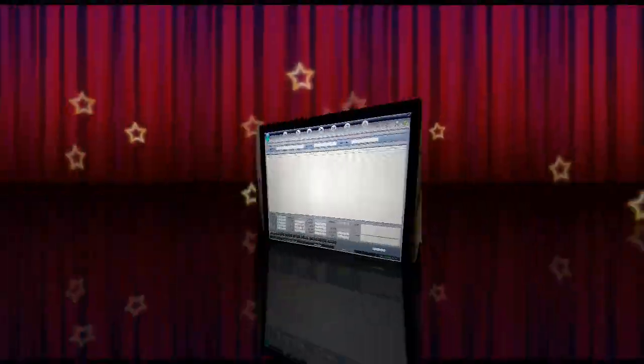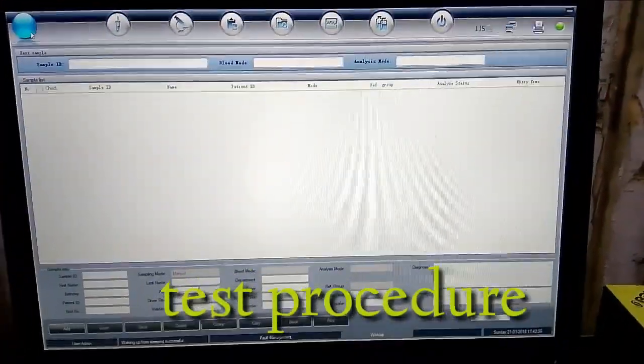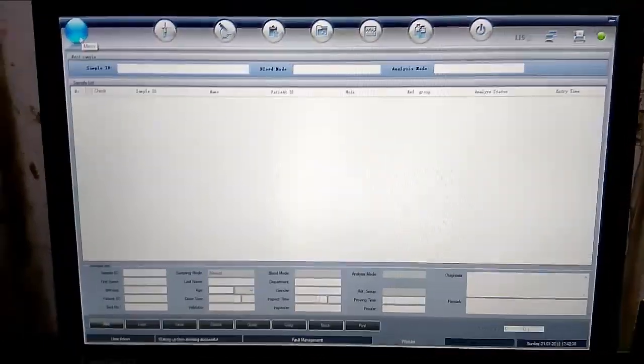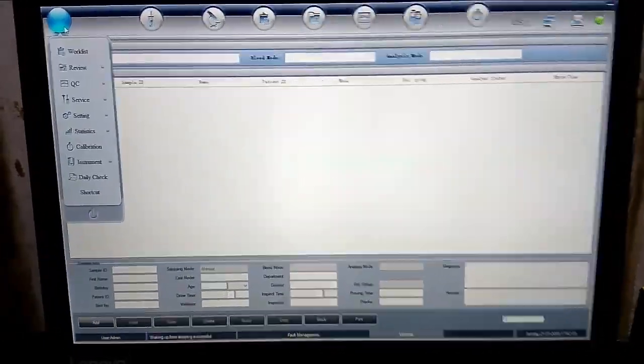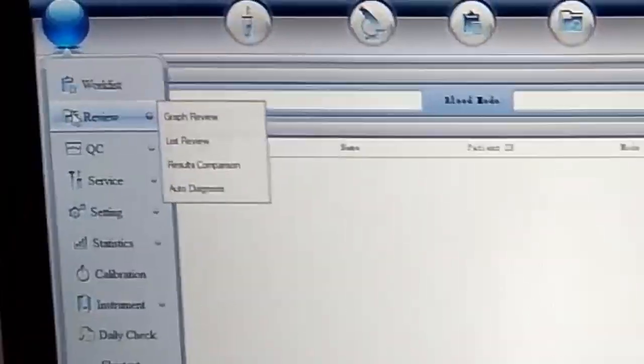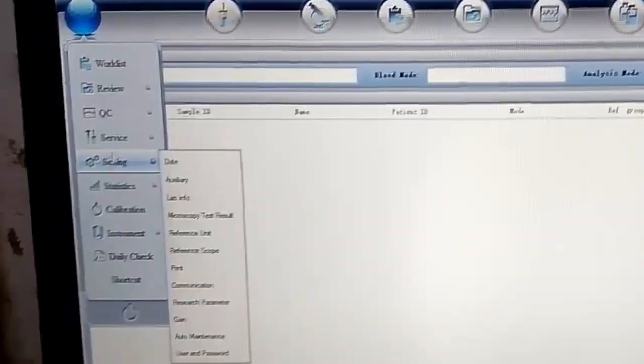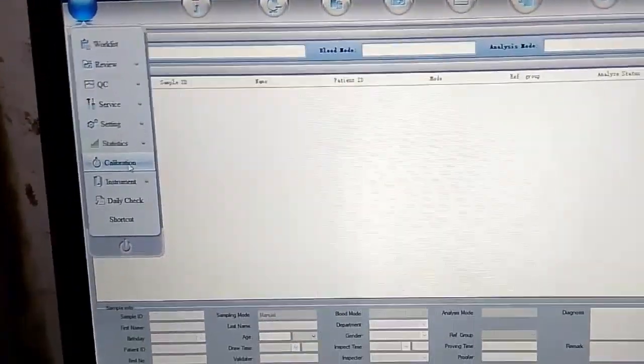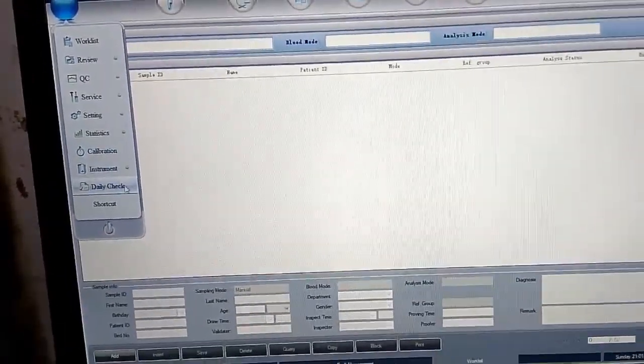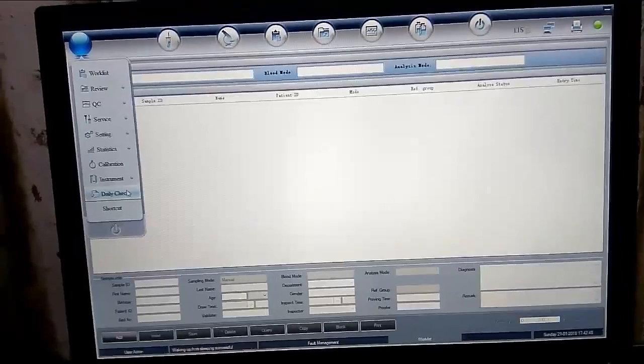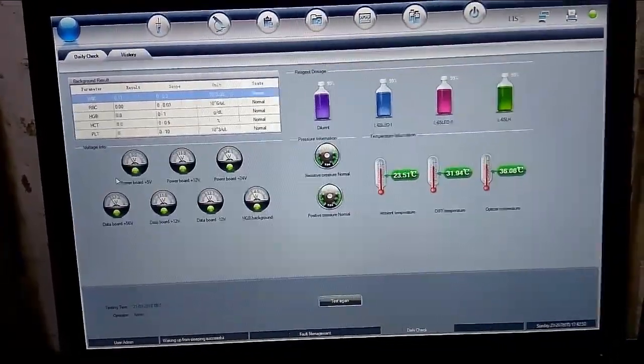What did we do? How to show you what we are doing. This is the video. There are work list, review, QC, service, settings, statistics, calibration, instrument, and daily check. When we start the daily machine, we will check the daily check.